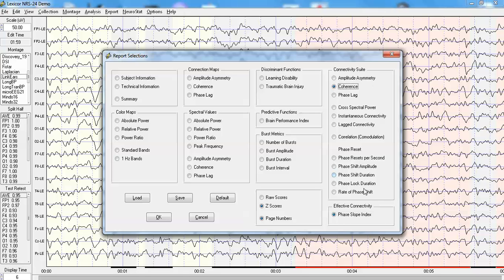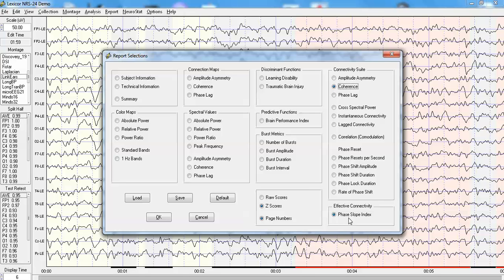And one will see a somewhat different picture from the Phase Slope Index in which the left hemisphere is compensatory. And we saw that in the previous image where the left frontal lobe had information flow going to different parts of the scalp surface, those scalp locations, but did not flow to the right parietal lobe where there was compromised neurons and damage to the cortex.